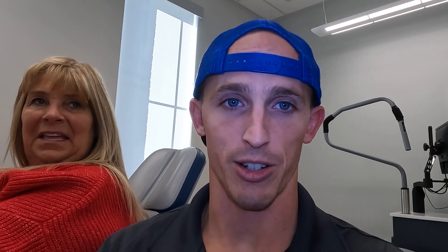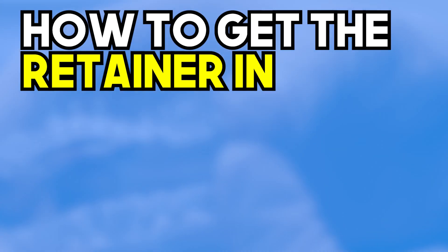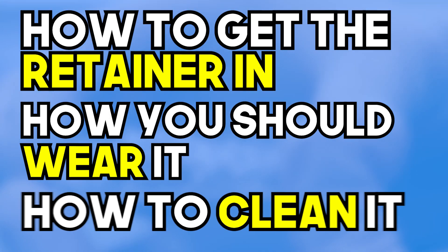We're gonna show you what they look like. We use a brand called the Vivera retainer — Invisalign produces it. We used to do some retainers made in the office. In fact, lots of orthodontists may do their own in-house clear retainers, with slightly different plastic or slightly different thickness. We're gonna show you what the Vivera one looks like, and then talk about how to get the retainer in, how you should wear it, and how to clean it.